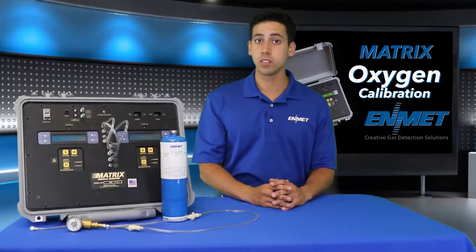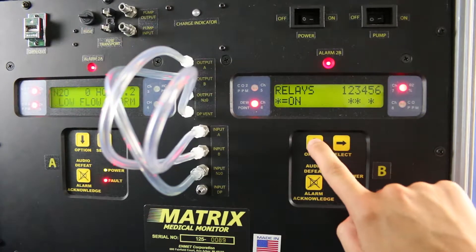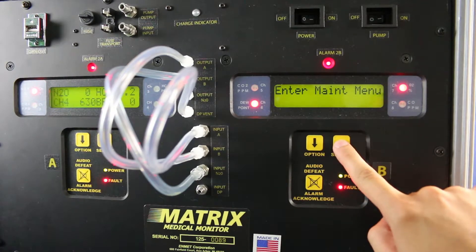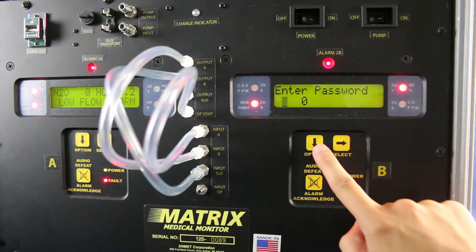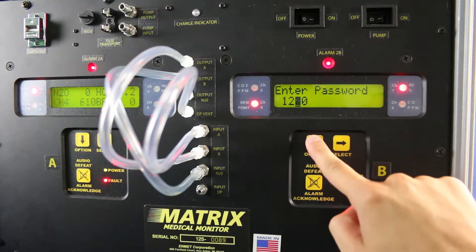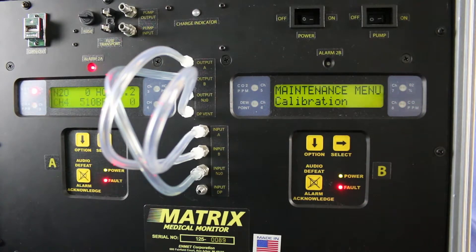To start the calibration process, you first need to enter the maintenance menu. To do this, press the option button until you get 'enter maintenance menu' seen on the screen, then press select to enter it. The password you need to enter is 1270, which is the default password. If that one does not work, you may want to try 3663, which is the alternative password. Once you have entered the password, the maintenance menu calibration submenu will be selected — press select to enter.